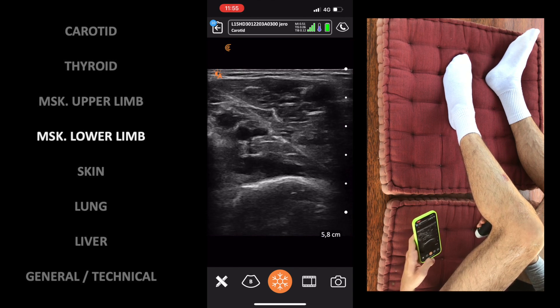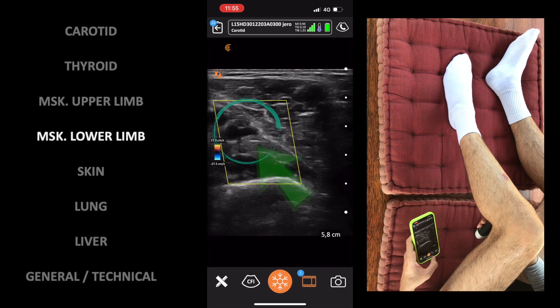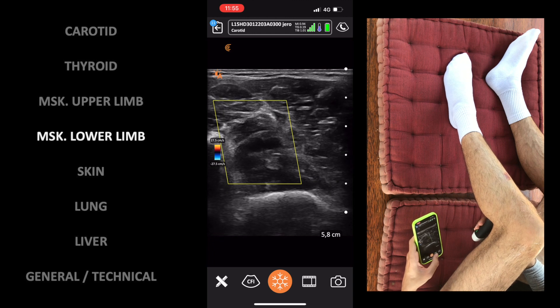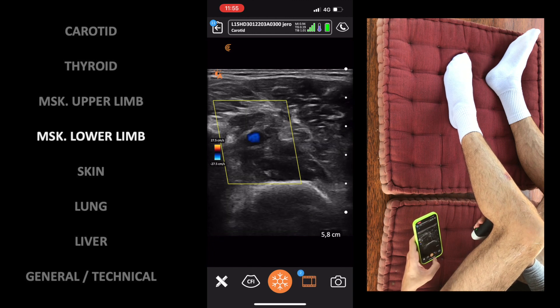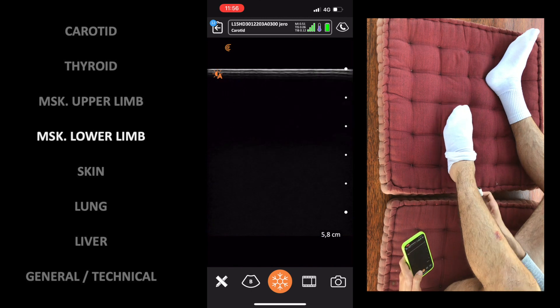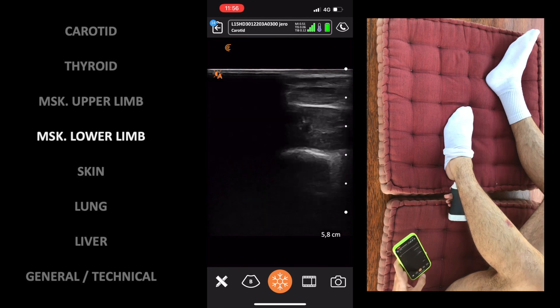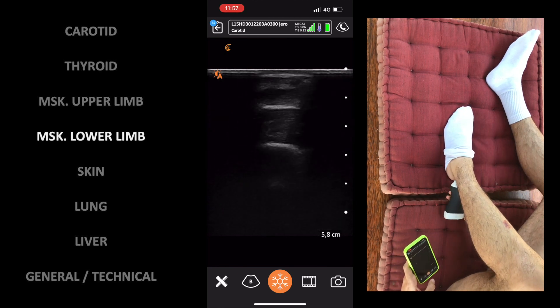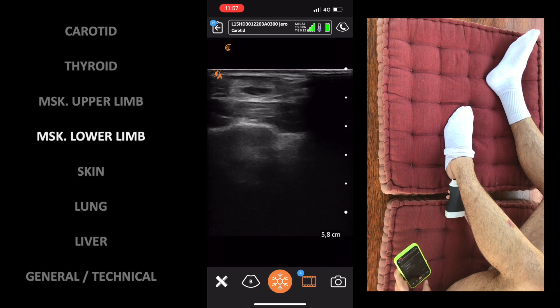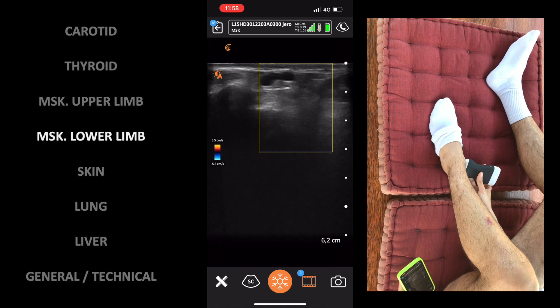Now assessing in real time the popliteal artery and vein with color Doppler to assess compressibility. Appreciate how they are collapsed or not when pressure is added — shown in the blue circle. The Achilles tendon — first the transverse section and then a longitudinal one. And finally, checking the posterior tibial artery pulse.